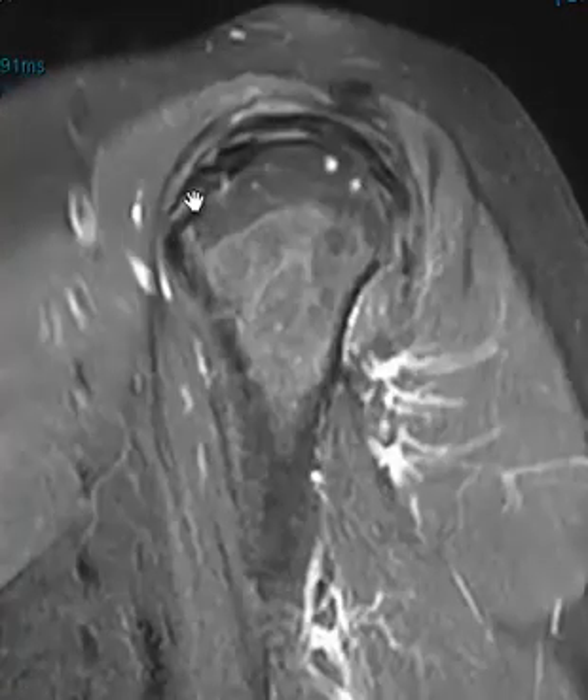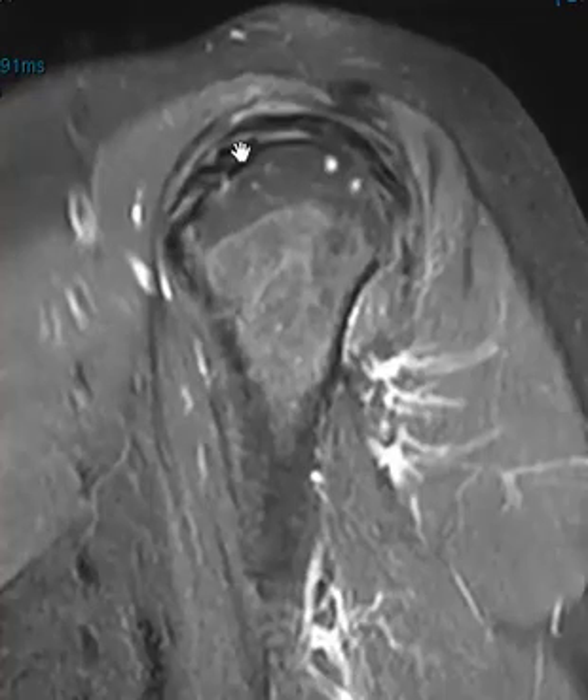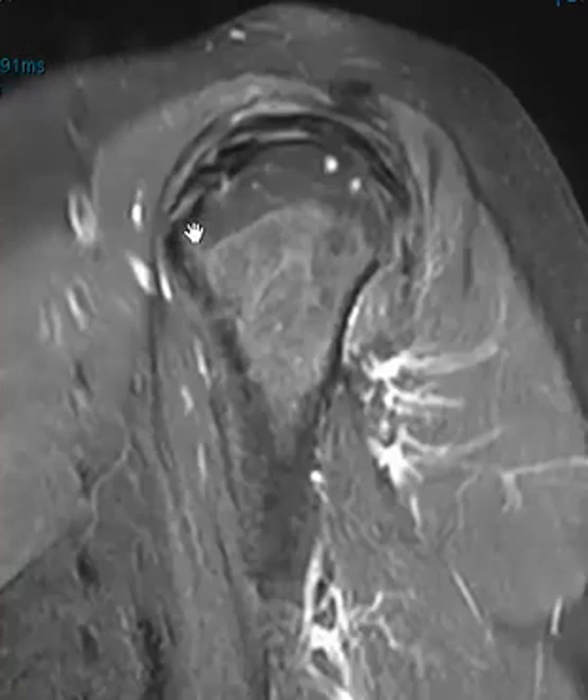We go forward to right at the attachment. It's a little bit bright, which is abnormal. Going back here, it looks a little foggy here too — very subtle. This is the biceps tendon, so I know anything in front of the biceps is going to be subscapularis, but it looks a little bit too bright.